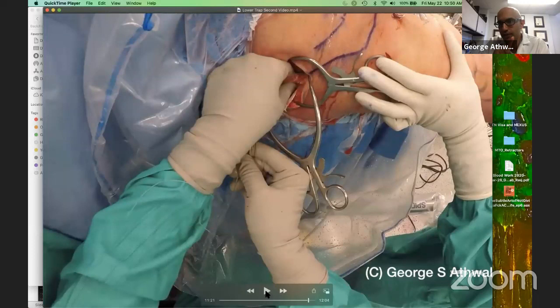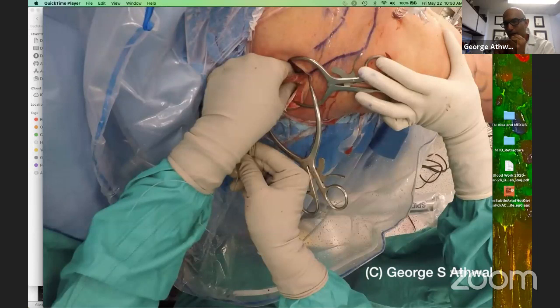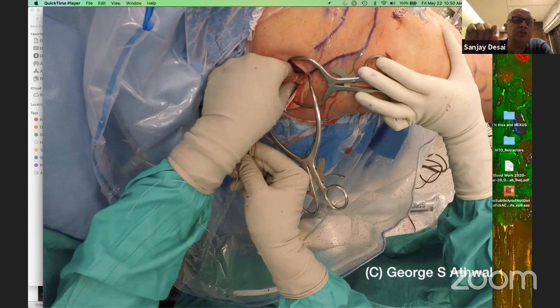So I have changed the technique slightly. In this part of the video, I secured one limb first. I've stopped doing that. Now I leave both limbs free and pass them into the tunnel. Then I equalize the limbs, tie one limb, and pull the other. So I don't have the problem of one limb being short, of a mismatch. The reason I changed is that one case where I couldn't get it back to the native muscle, and I had to suture it to the tendon, which I didn't like.